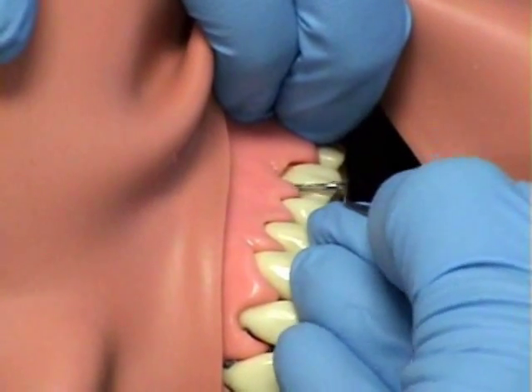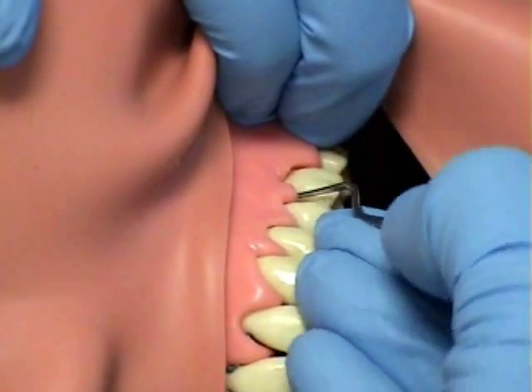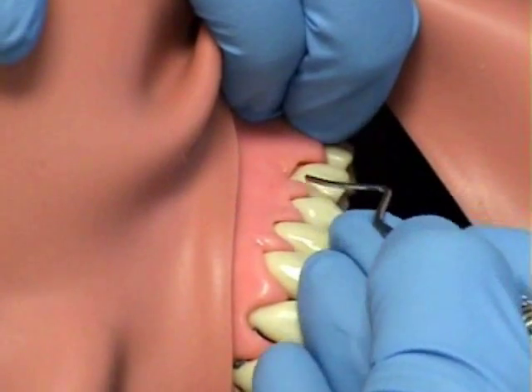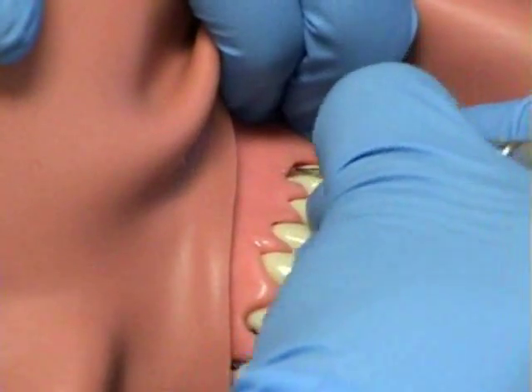Ms. Johnson is using a mesial distal furcation curette. They come in two sizes. One is 0.9mm, the other is 1.3mm. That describes the width of the blade.